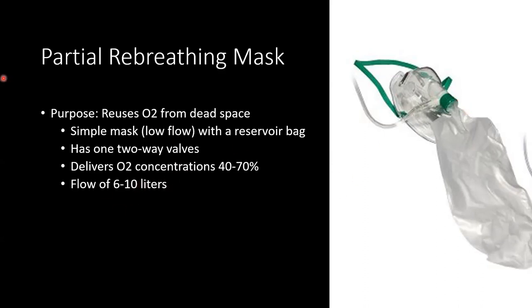So when the patient breathes, there's also an additional contribution of the volume of what the patient is going to breathe, and that is the holes at the side of this mask. So when the patient breathes, he actually is going to rebreathe part of the volume that he exhaled, as well as from the oxygen source and also from the ambient air.